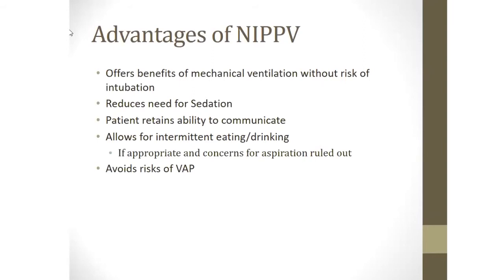The advantages of non-invasive positive pressure ventilation: it offers the benefits of mechanical ventilation without the risk of intubation. It reduces the need for sedation. The patient retains the ability to communicate and talk, and it allows intermittent eating and drinking.